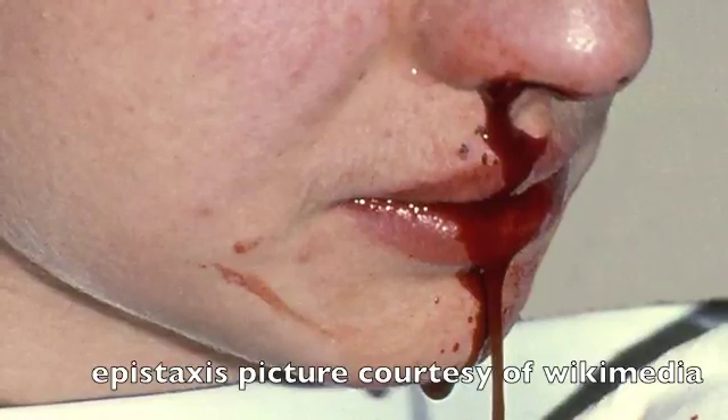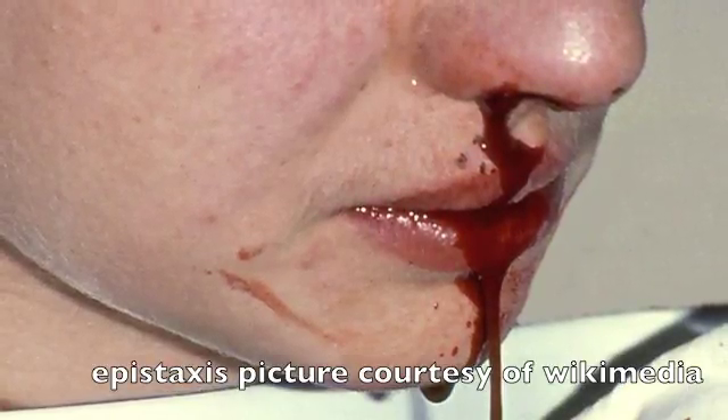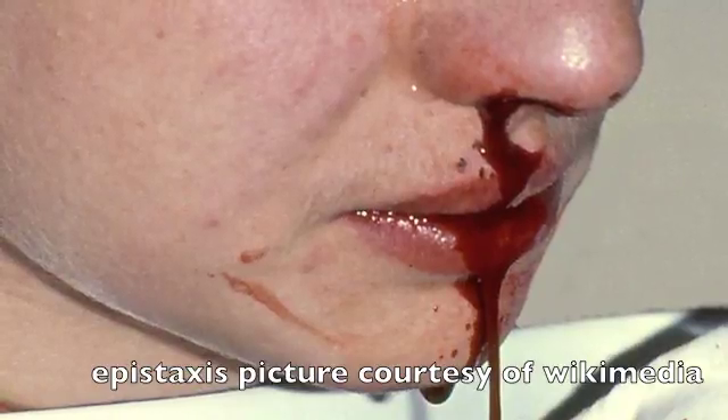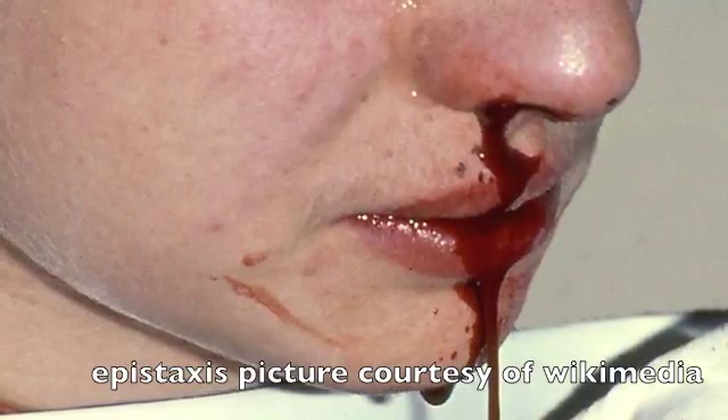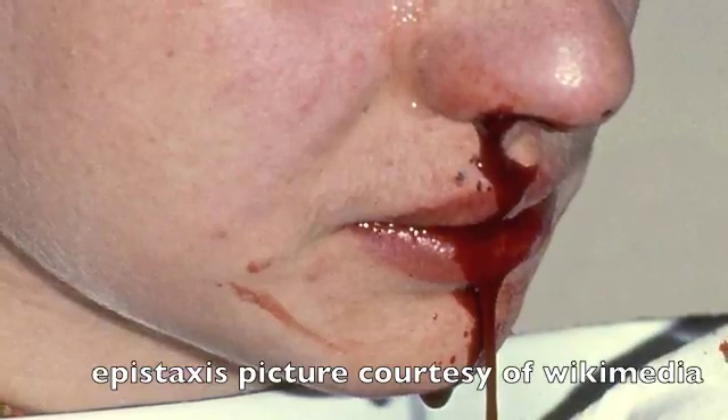Epistaxis is typically treated with cautery as well as packing, but when these efforts fail, it may be necessary to bring the patient for surgical ligation of arteries or perhaps embolization per interventional radiology.